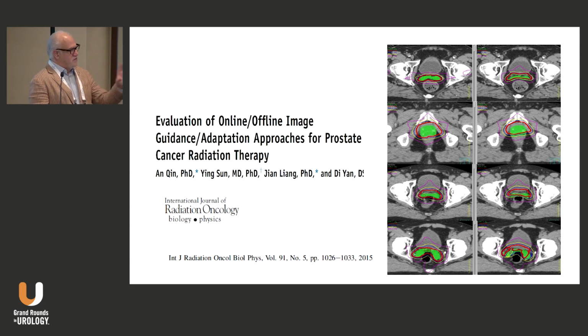And the same thing, let's say for SBRT, where it's 5 high-dose treatments. I'll talk about that later in the course. We make our patients have an enema, so that we are clearing out the rectum so that it is in the same state at the time of simulation and at the time of treatment. If you do these things, you will see less changes.